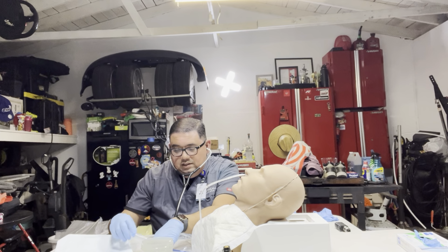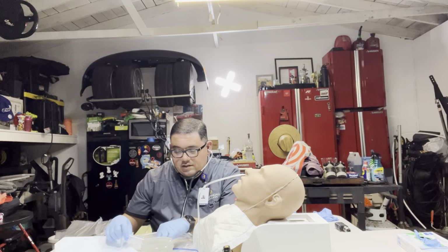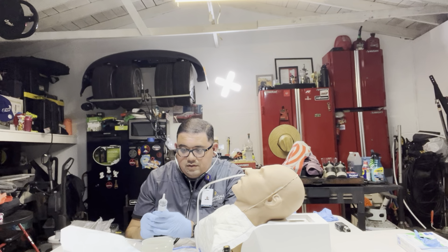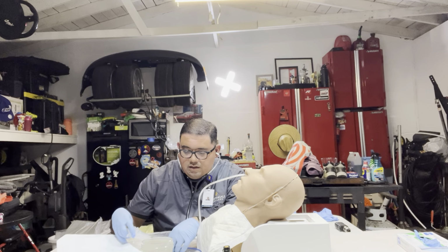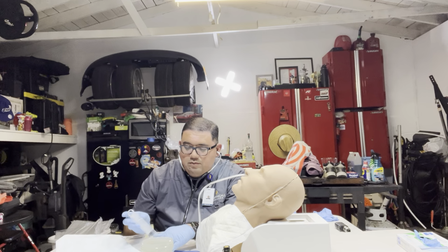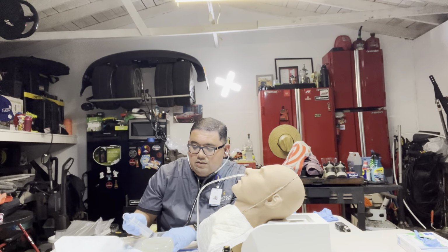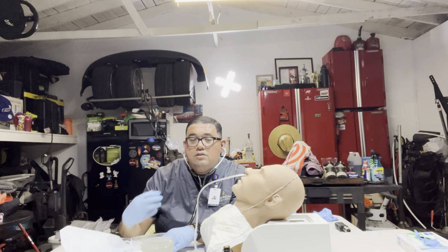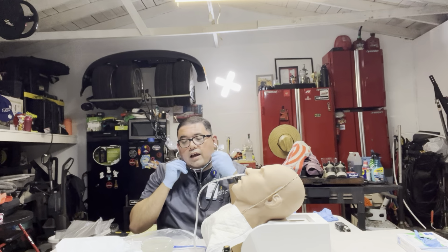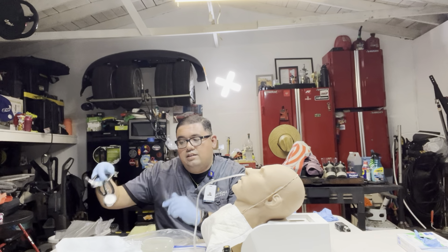You can inject about 10 mLs of air, and with your stethoscope on the abdominal area, as you insert the air, you would hear a swooshing sound. Usually we can tell with that we're in the stomach area.